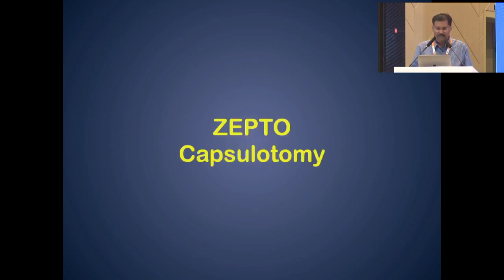So coming to Zepto, who all are using Zepto? Last week at ASCRS, they launched a new platform which is connected to the machine itself. It can do the suction and all can be connected to the machine itself without having a separate unit. And so it is also developing. We used it for a demo purpose.